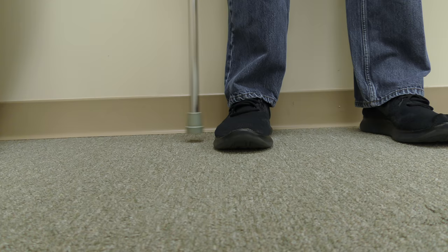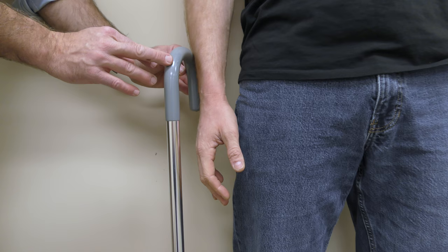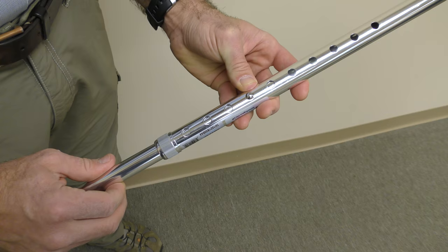To properly fit the cane, first place the tip of the cane against the side of the foot. The top of the cane should be about wrist height — so this is too high. Make the adjustment and try again.